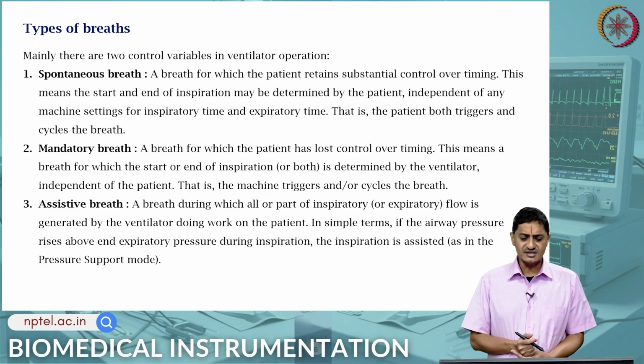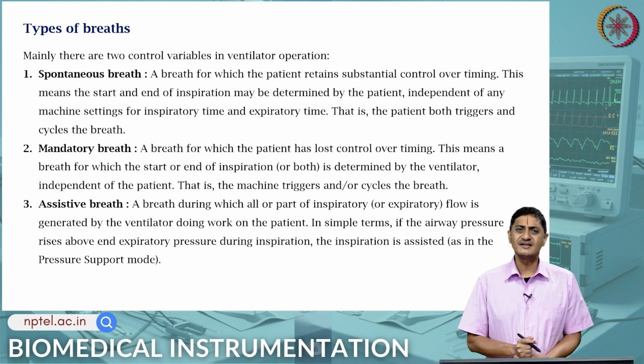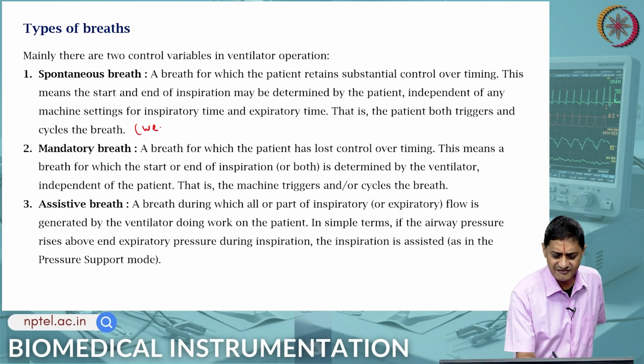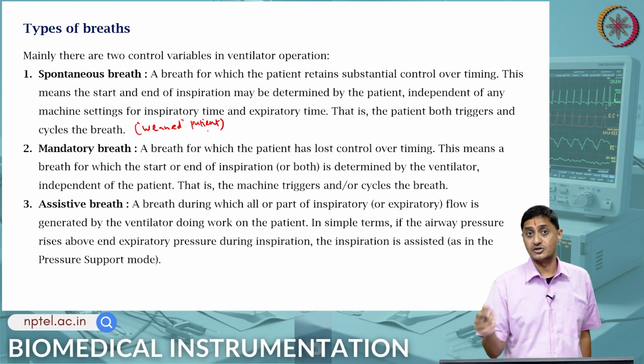Especially for the inspiratory time and the expiratory time, the patient both triggers and cycles the breath. This is a situation in which the patient is almost independent and almost weaned. This is a weaned patient, maybe, or a patient with less pathology.